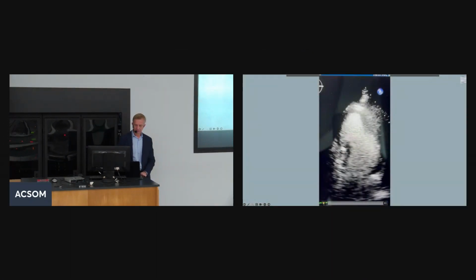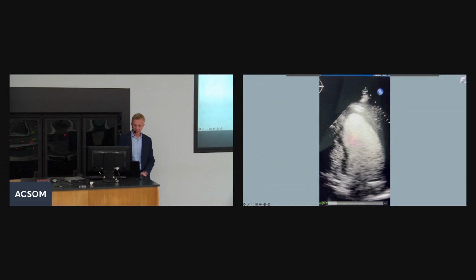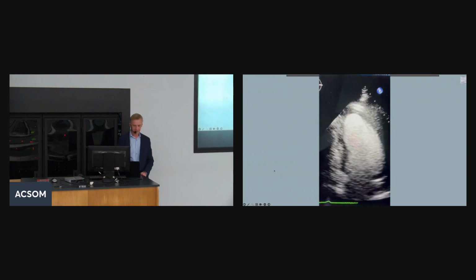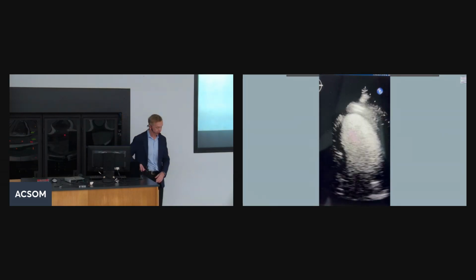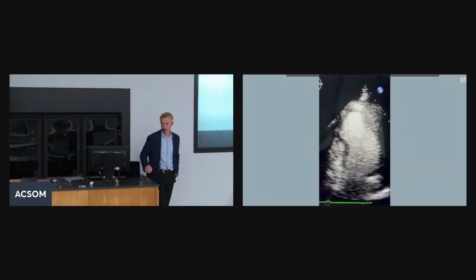I think yesterday when I was reading your cardiograms, we talked about the cardiomyopathy and different types, ischemic versus non-ischemic. So I will show you just one patient that I read an echocardiogram on yesterday, and I'd like you to participate. So it's moving. So this is the heart. This is the echocardiogram with contrast, and this is the image of the left ventricle.